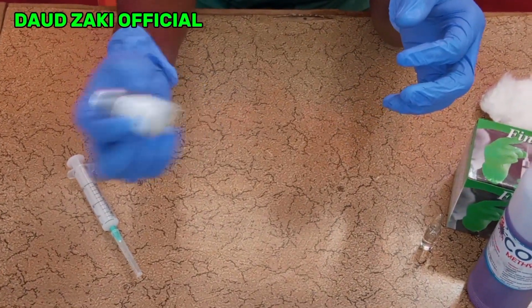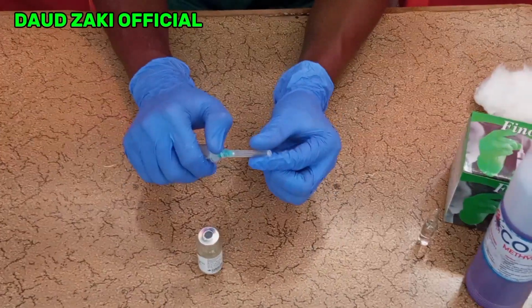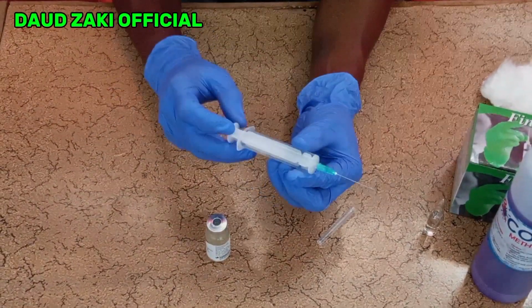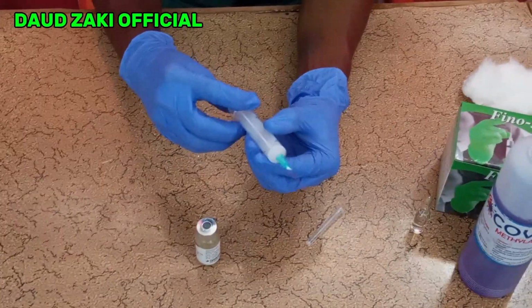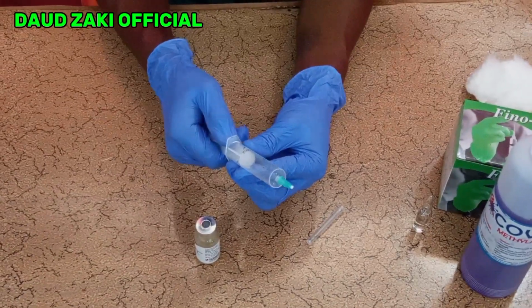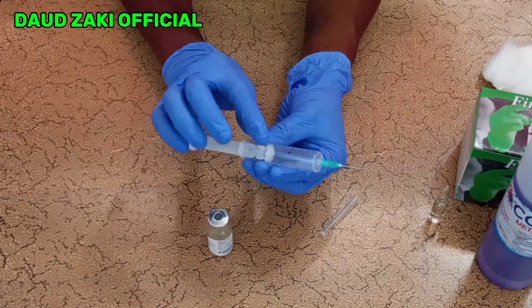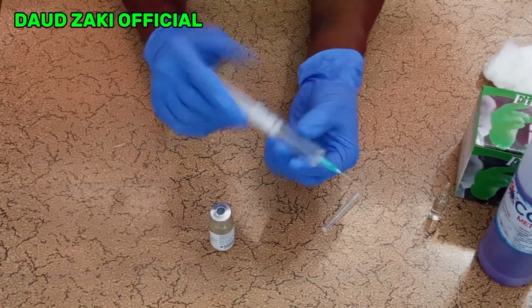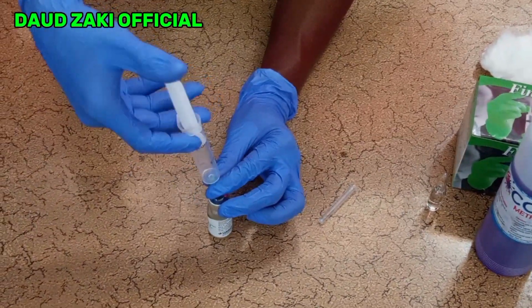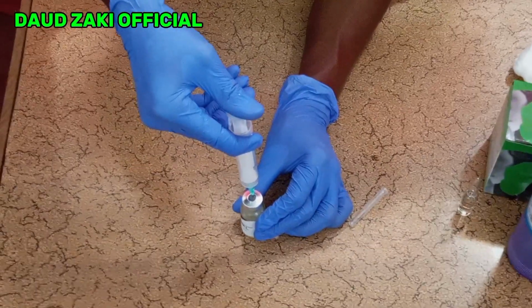So this is how you shake the vial for it to dissolve gently. Now we want to withdraw. Before you insert the needle into the vial, make sure that you remove any air bubble. You have to put an equal amount of air into the vial so you can withdraw the drug. So you pull back the plunger to 10 mL and inject that air into the vial.